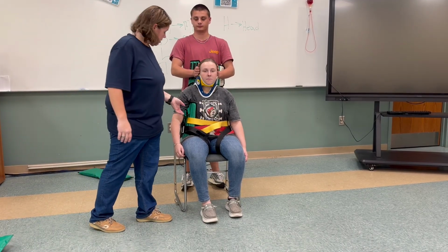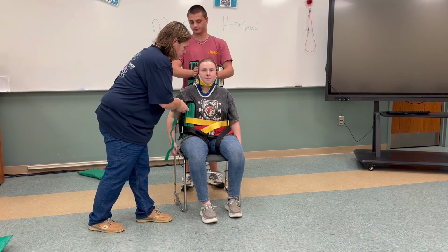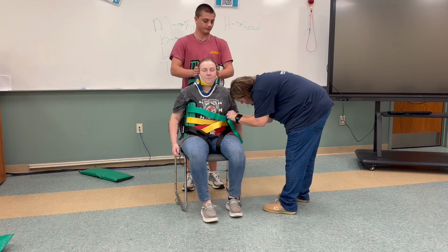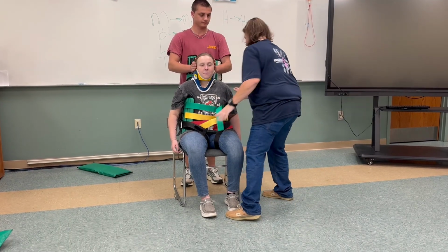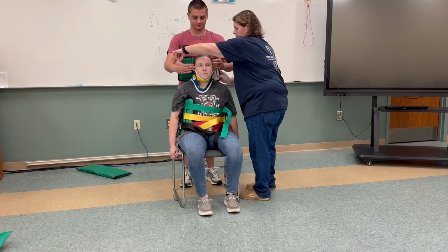Now we go to top, which is this one. All right. One more just across your chest, and I know it's tight, but there is a reason for that. All right. Okay. Now we have top. Next, we're going to do head. This is where you may need to keep holding C-spine, please.